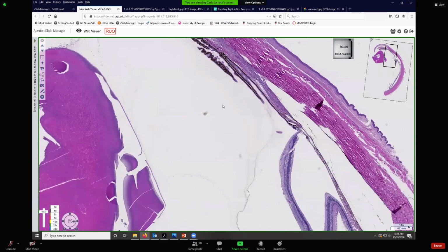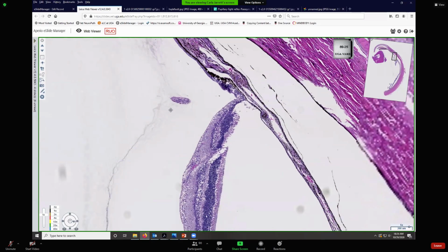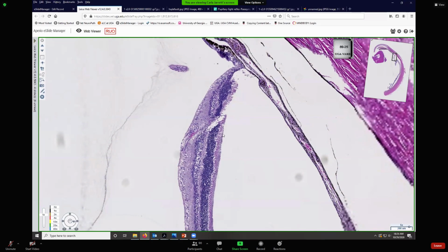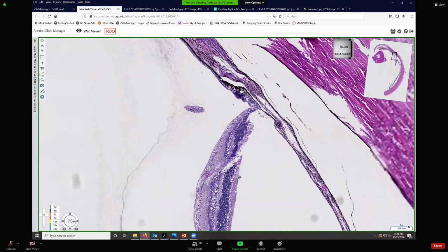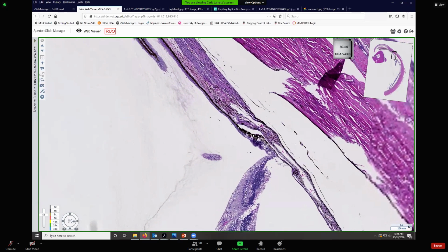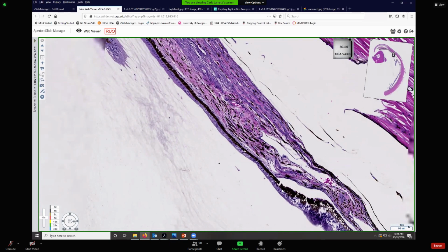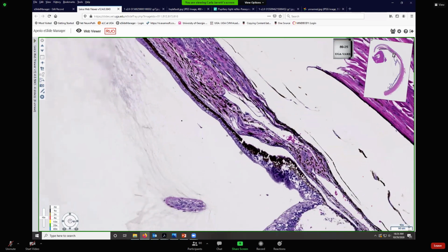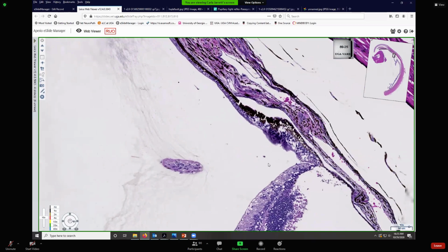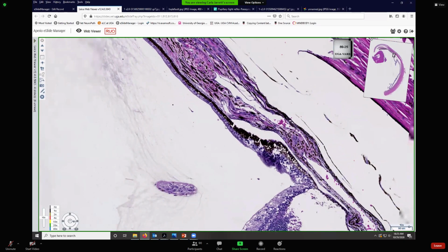Now, the ciliary body starts at the ora serrata. And I mentioned that yesterday. The ora serrata is where these 10 or 11 layers of the retina cone down, taper down, and then become just the bilayered epithelium of the non-visual portion of the retina. The retina has the visual portion and the non-visual portion. So this is the pars optica and the pars ceca, the non-visual. So we go from 10 or 11 layers to 2 layers.